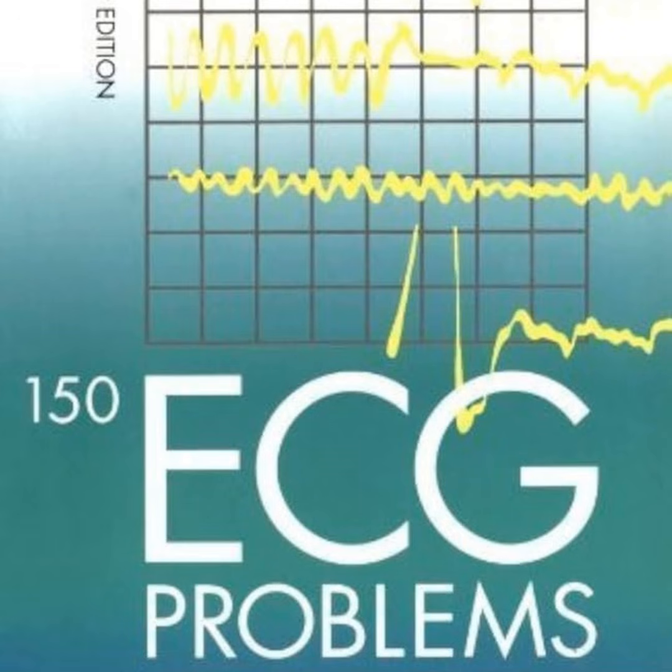Yep. So what's happening there? You really have to visualize the vector physics here. In a normal, healthy heart, the left ventricle is massively thicker than the right. So the dominant electrical vector pulls leftward and posteriorly. Right, away from lead V1, since V1 sits right over the right ventricle. Exactly. And that away vector produces the normal deep negative S wave you expect to see in V1.